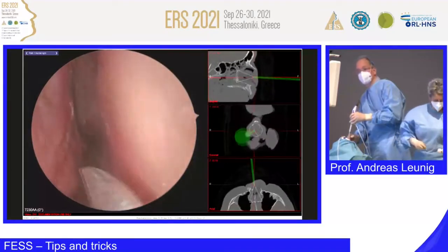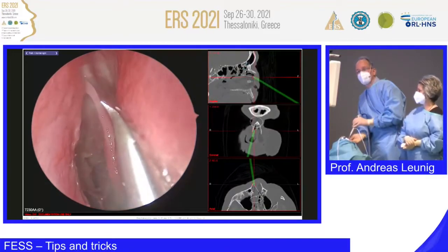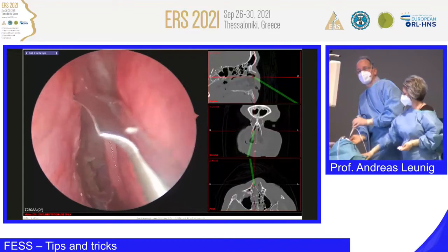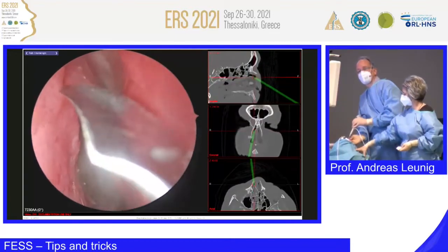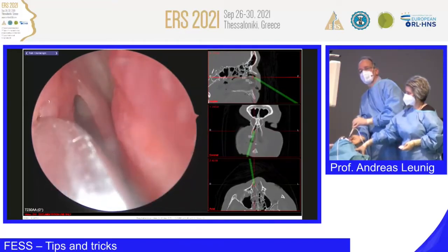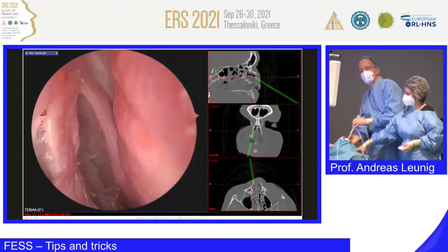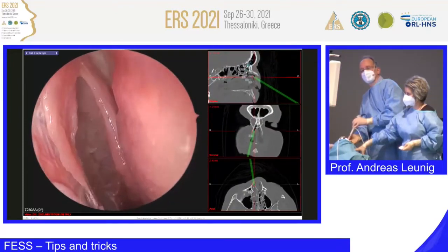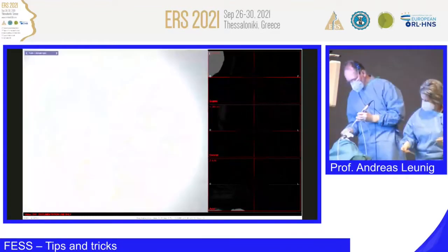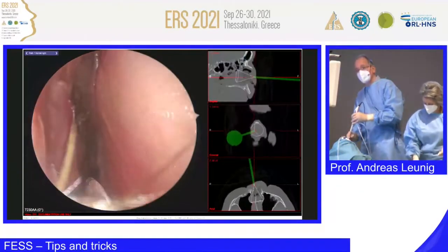Yes, we still have time, that's good. Okay, so you go a little bit above the axilla of the middle turbinate. Hold the head, and we make a flap here. We go directly on the bone. You can make it wider, higher up as well, but I always try and start like this. Then a Freer, please. You can even save this flap, or you can just resect the flap. We'll see how it works.